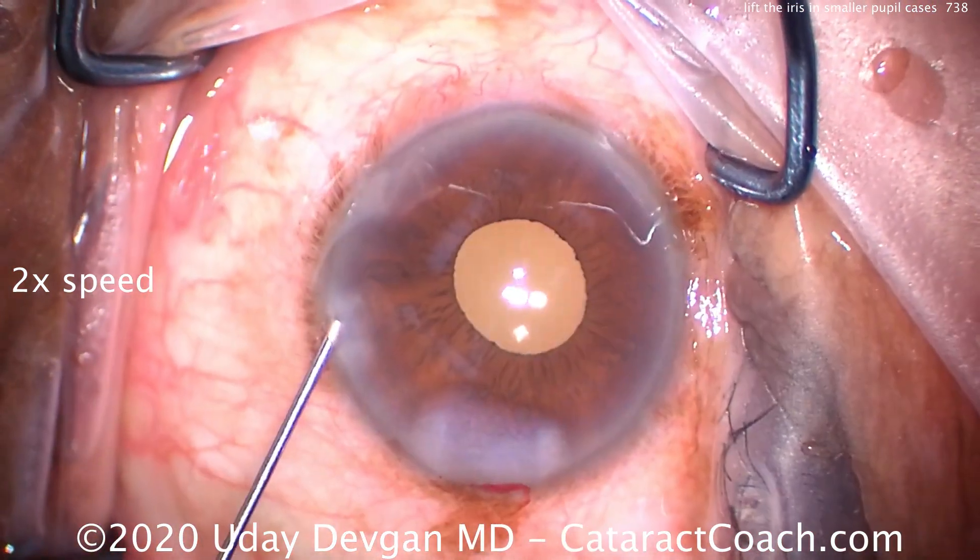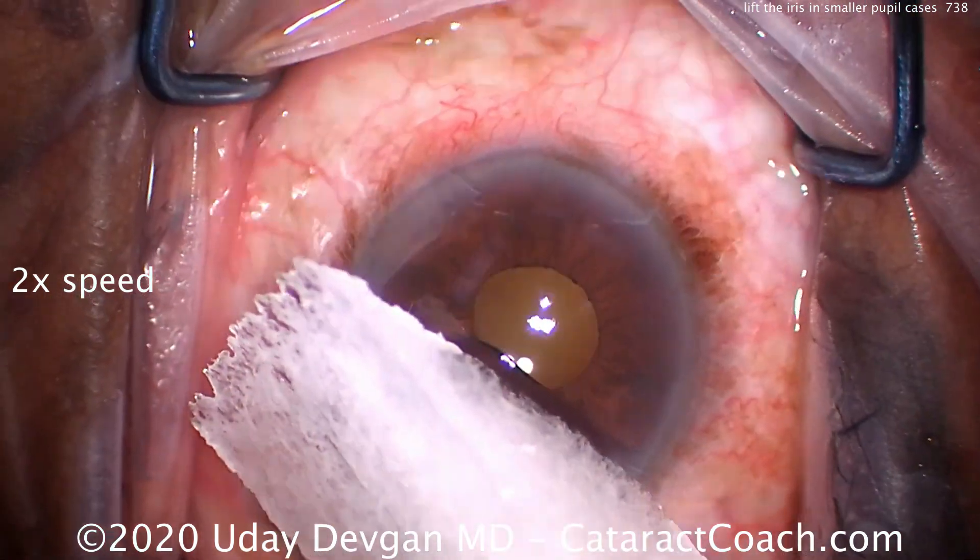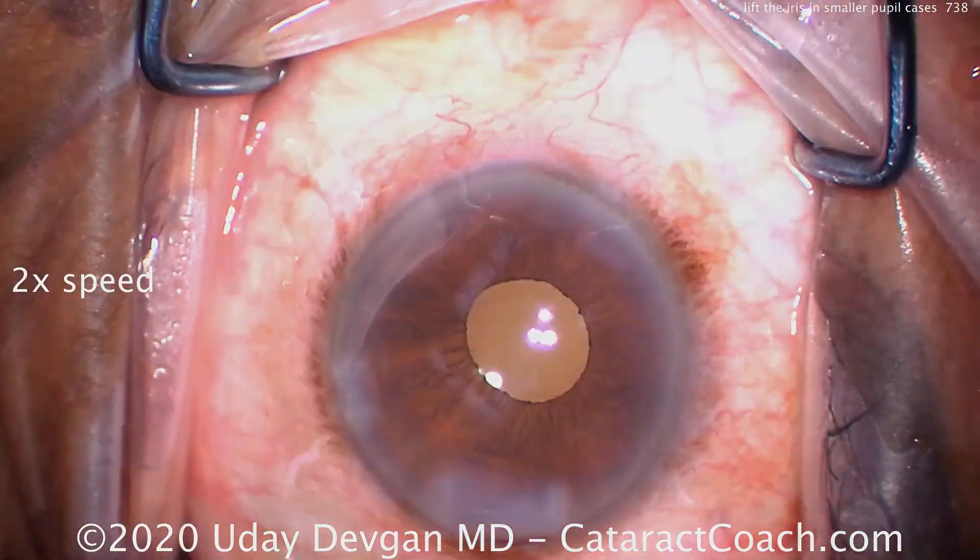This is a very smart move. And now you can see at the end of the case, the pupil is actually relatively small — that viscoelastic was keeping it dilated.